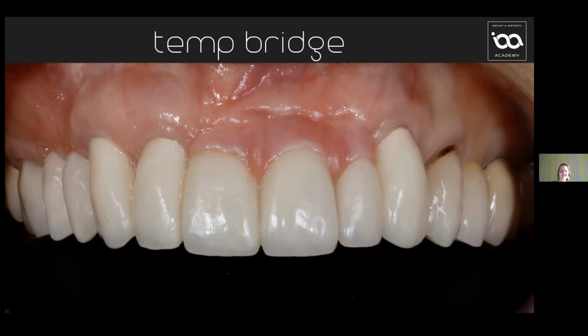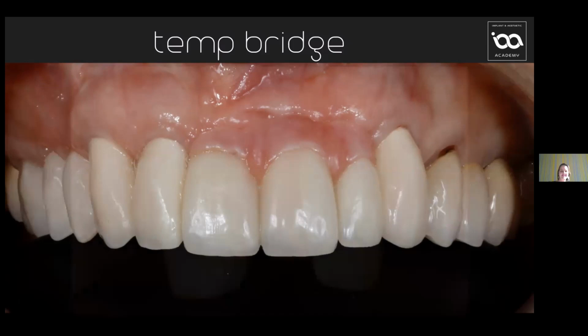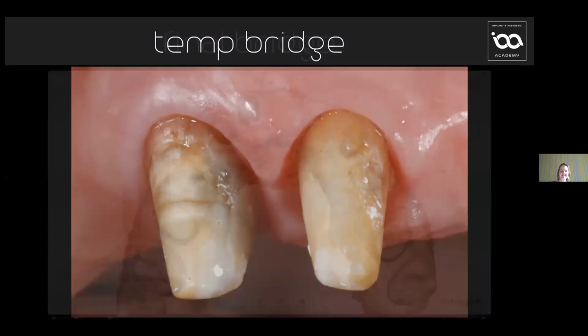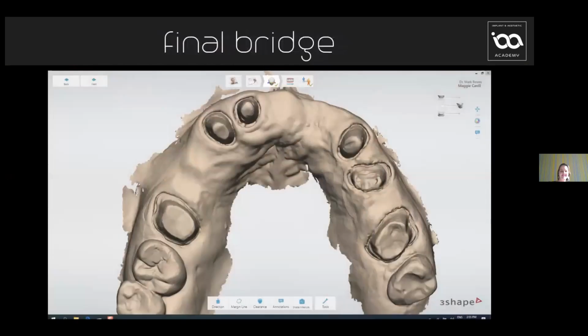There's no re-prepping the tooth. The prep is done in the first visit. If I'd placed a horizontal margin, it would have been an issue. And when I say that you get this sort of soft tissue, I've never seen this in horizontal preparations. We take these off after 3 months, and you can see the situation that we have, the thickness of the tissue, and more importantly, the health of the tissue. You know, it's just one of those amazing things that really changed a lot.